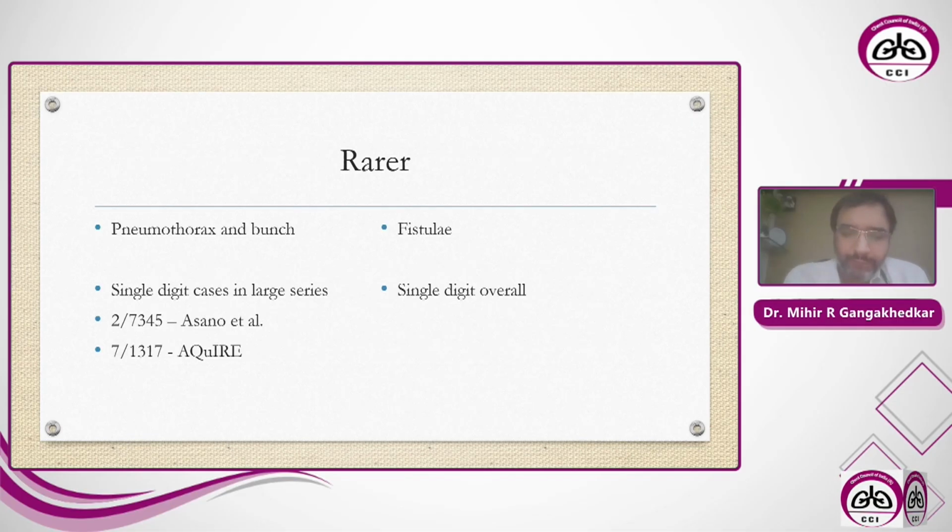The other rarer non-infective complications would be pneumothoraces, fistulae as such, but all reasonably rare even in the large studies. And you would rather find them more commonly when you're doing it with an accompanied procedure like a transbronchial biopsy as well.